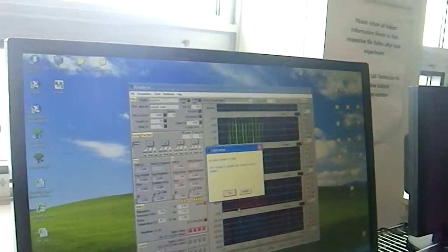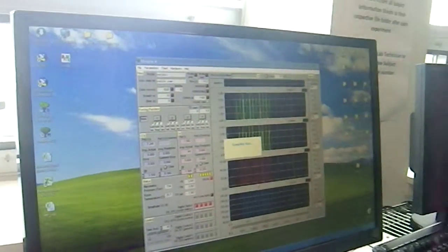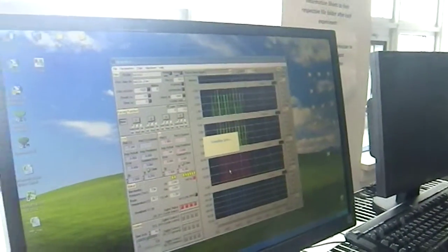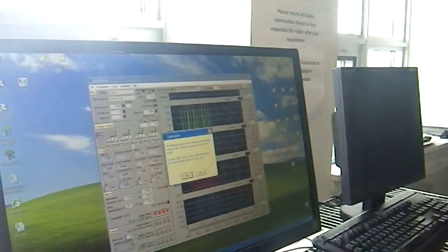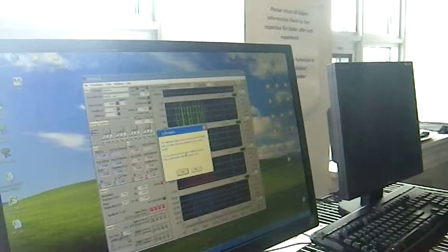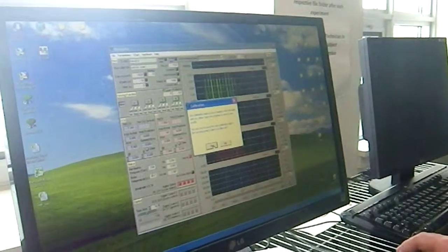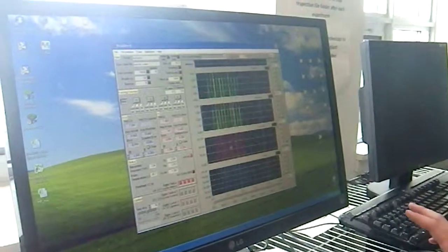This is just pulse oximeter. You can just hit OK on these. And then we'll do it again. OK. So this now is asking if you want to save it as the file name you picked. I usually hit yes in case you do other testing for the day or within a few hours, and then you don't have to redo the calibration for each time. So now calibration 1 is done.